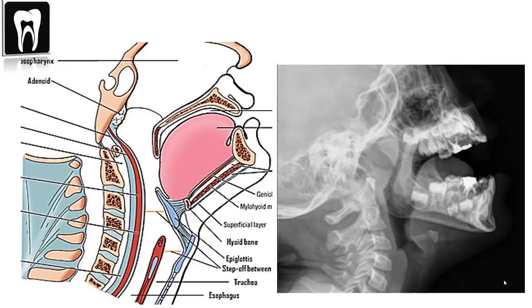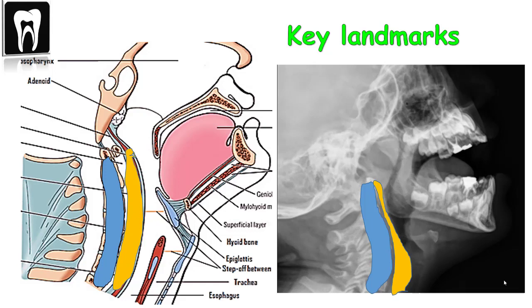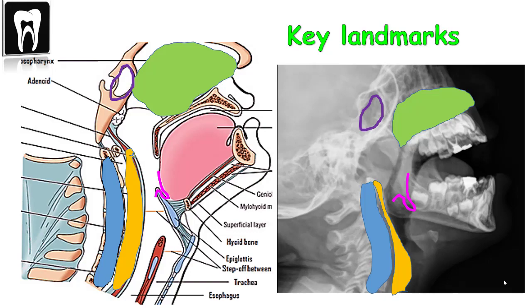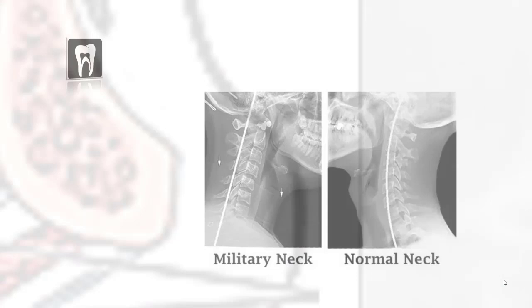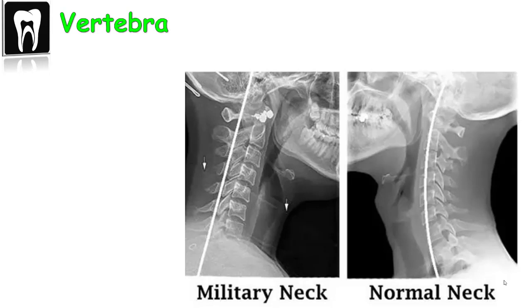This is what comes out on the X-ray. Look at the key landmarks that can be helpful: the cervical spine, the prevertebral shadow, the folds, the nasal cavity, the sphenoid sinus, and the C-shaped shadow which is the adenoid.